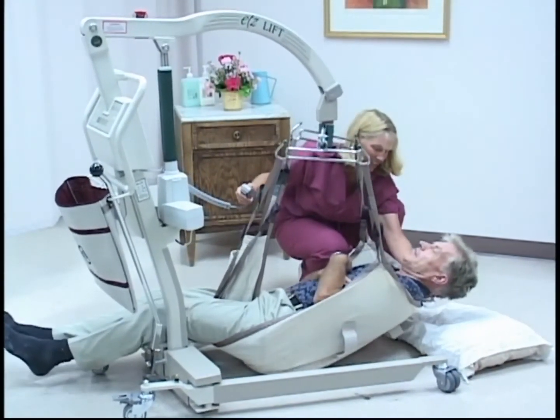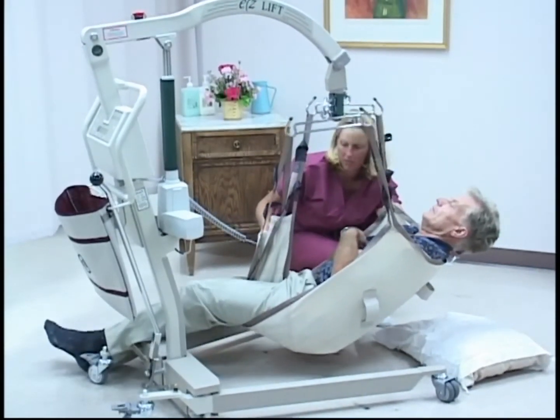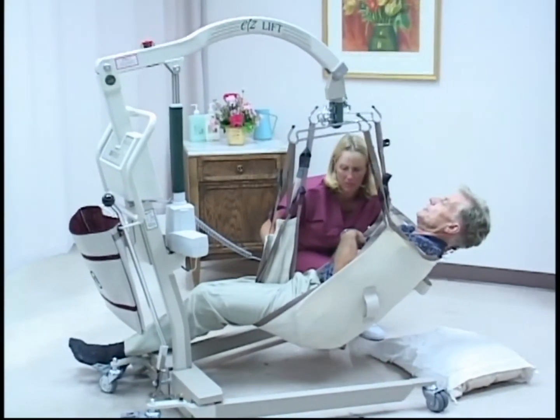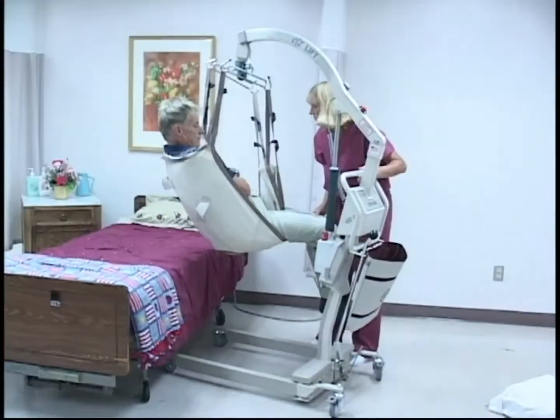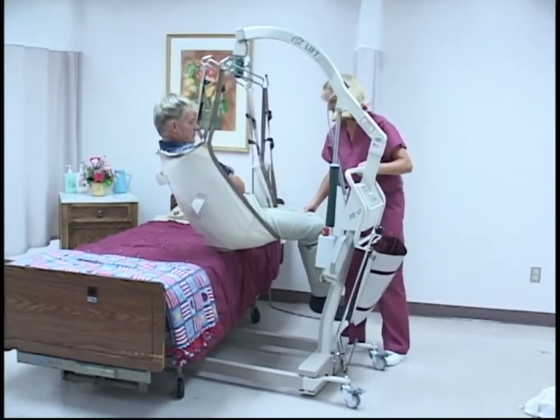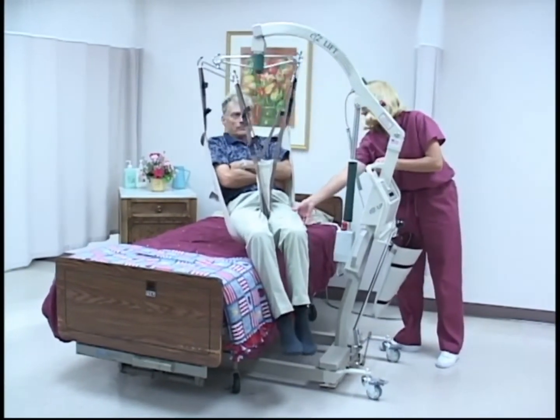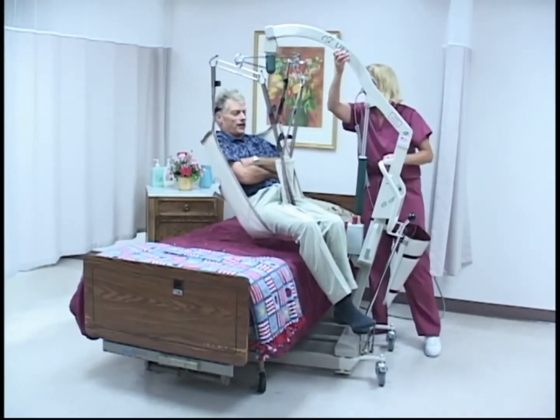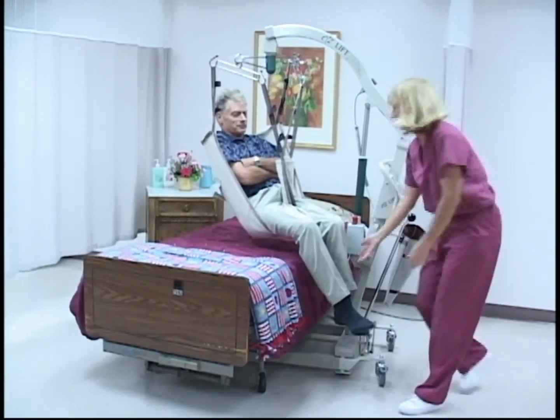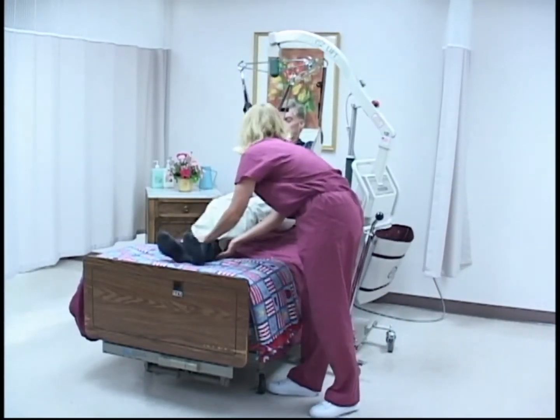When the patient is off the floor, rotate the patient's legs away from the mast. Continue lifting until the patient is at the desired height. Roll the patient into position next to the bed. Swing the patient's legs up and around and center their feet at the foot of the bed. Reposition the patient so they are centered on the bed.